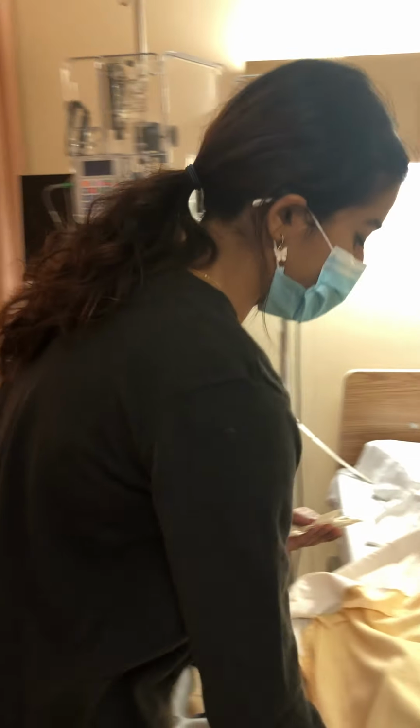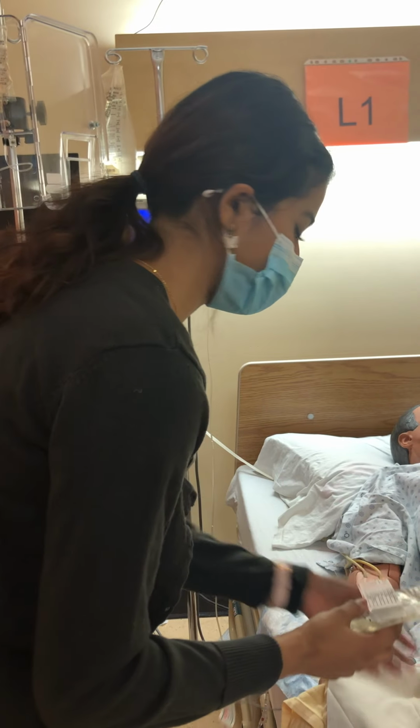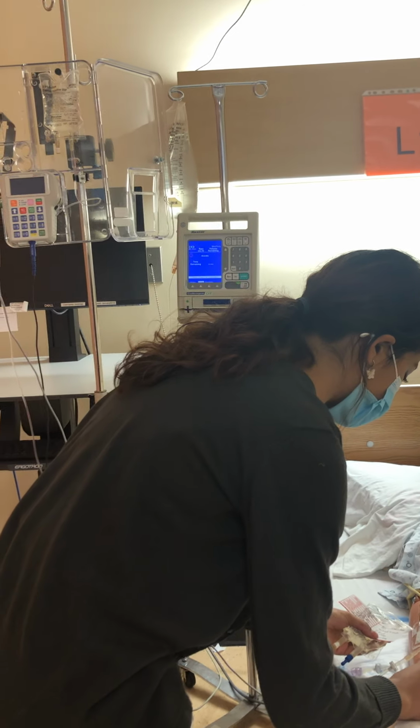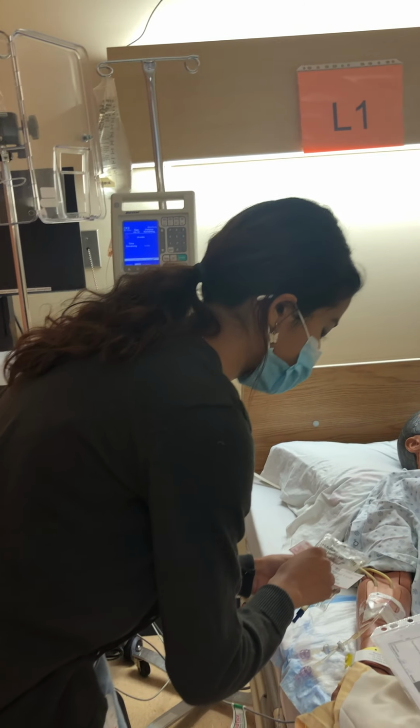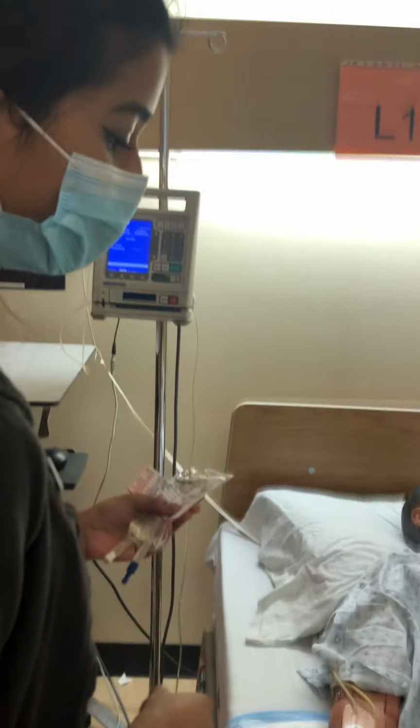I'm going to introduce myself. Hi, my name is Ayesha Anwar. I'm going to be your student nurse today. I'm just going to have a look at your wristband. So I'm going to be comparing it with the label, with the MAR, with the wristband. So we have right patient, Paris Marcy, and I'll just ask them to verbalize their name and their date of birth. Okay, patient's done that. And I'll ask them if they have any allergies.